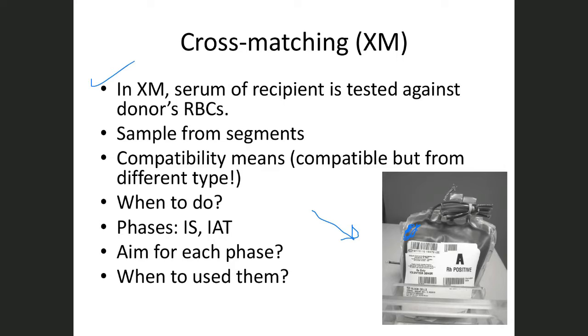Yes, Ashwag, why? Why shouldn't we do that? We don't have the donor serum. A donor sample, for example, we keep it for only 1 week after donation. Then we don't keep it anymore. Okay, so we will not find the donor sample. So what do we do?